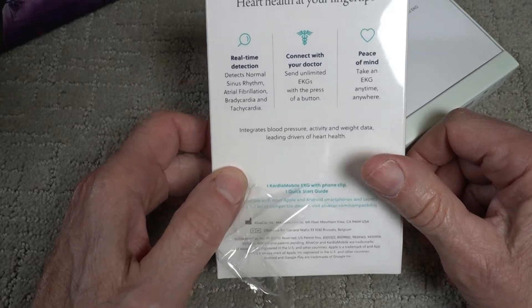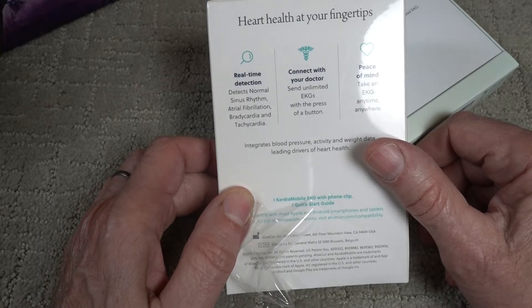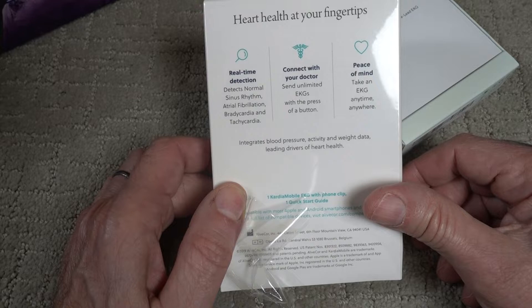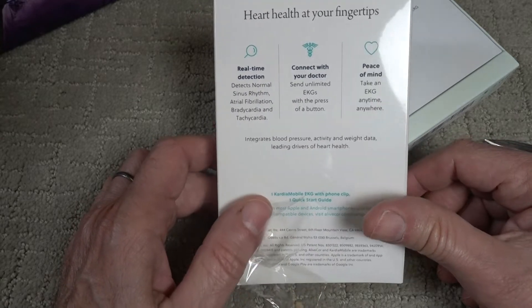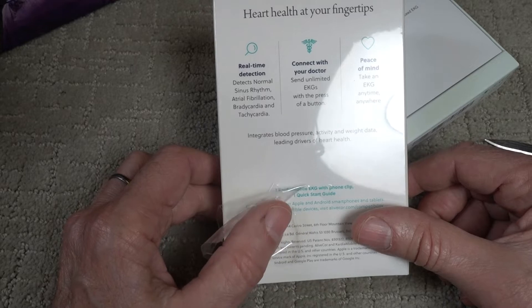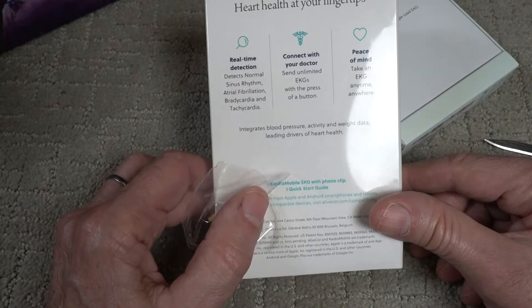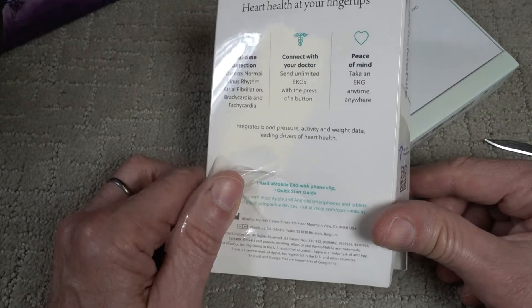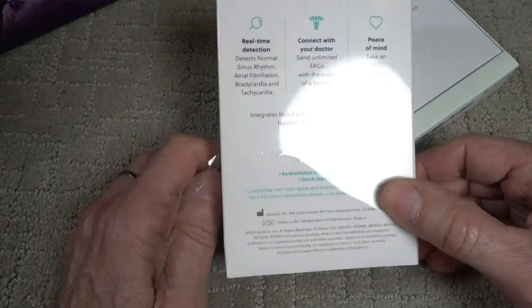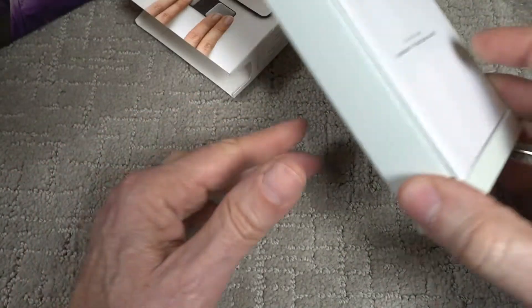This offers real-time detection, detects normal sinus rhythm, atrial fibrillation, bradycardia, and tachycardia. Tachycardia is what the doctor thinks I have. It connects with your doctor, and you can use it any time. What this is not — it's not a device or a harness that you wear all the time. You just pull it out, take a reading when you feel something is abnormal. You probably should also send a normal reading to your doctor so he has a baseline. It says it integrates blood pressure, activity, and weight data. I don't know how it does all that, but advances in modern science.